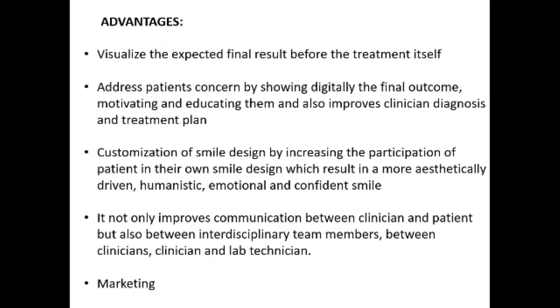So coming to the advantages, it helps in visualization of the final expected result before the treatment itself. It can help address the patient's concern by showing digitally the final outcome and motivating and educating them. It helps in customization of the smile design by increasing the participation of the patient in their own smile design. And it helps in arriving at a more aesthetically driven, humanistic, emotional and confident smile.